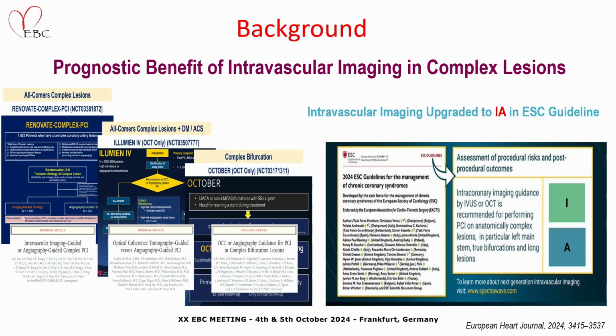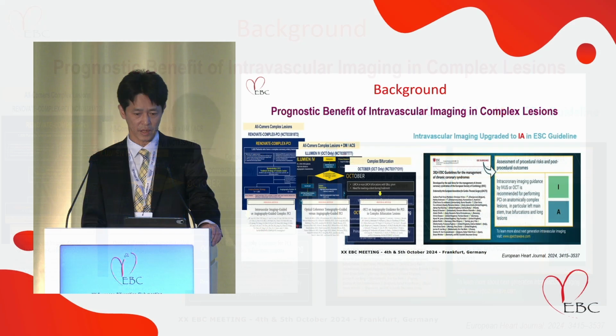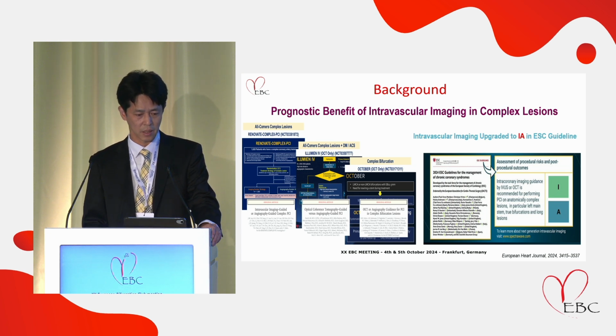Additionally, intravascular imaging has gained considerable attention for its role in optimizing outcomes in complex lesions. The latest ESC guideline upgraded the recommendation for intravascular imaging to class 1A in complex PCI.